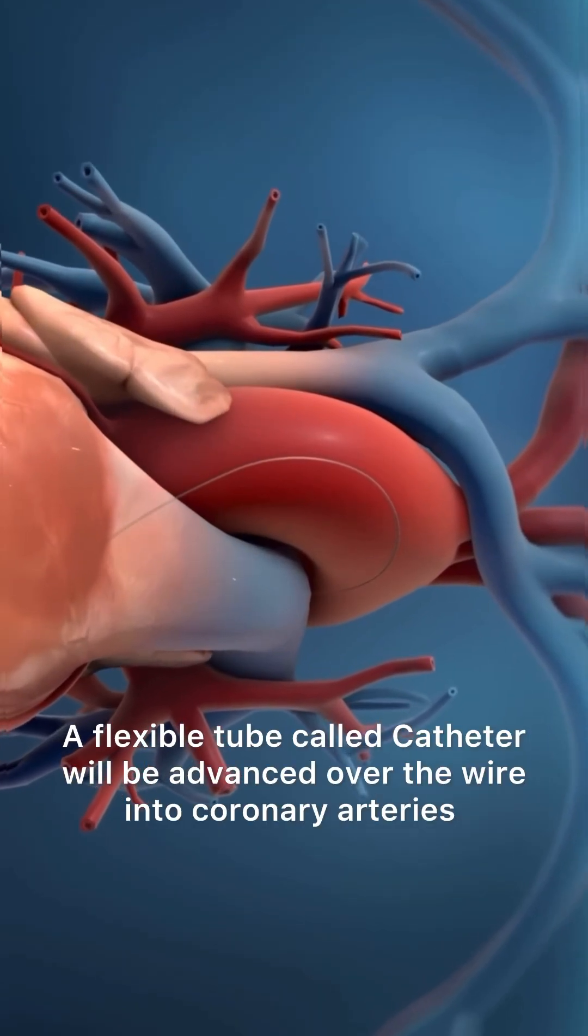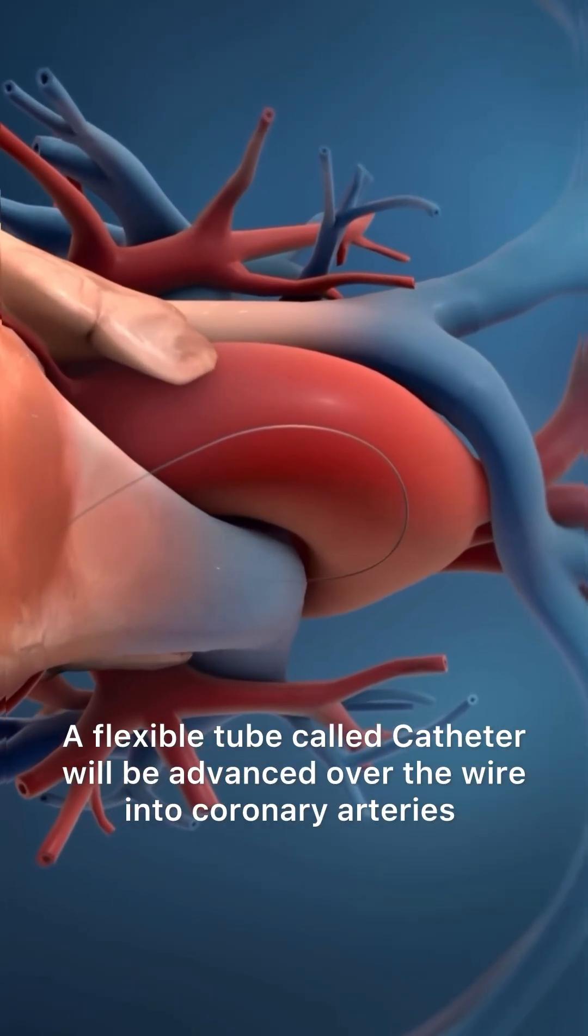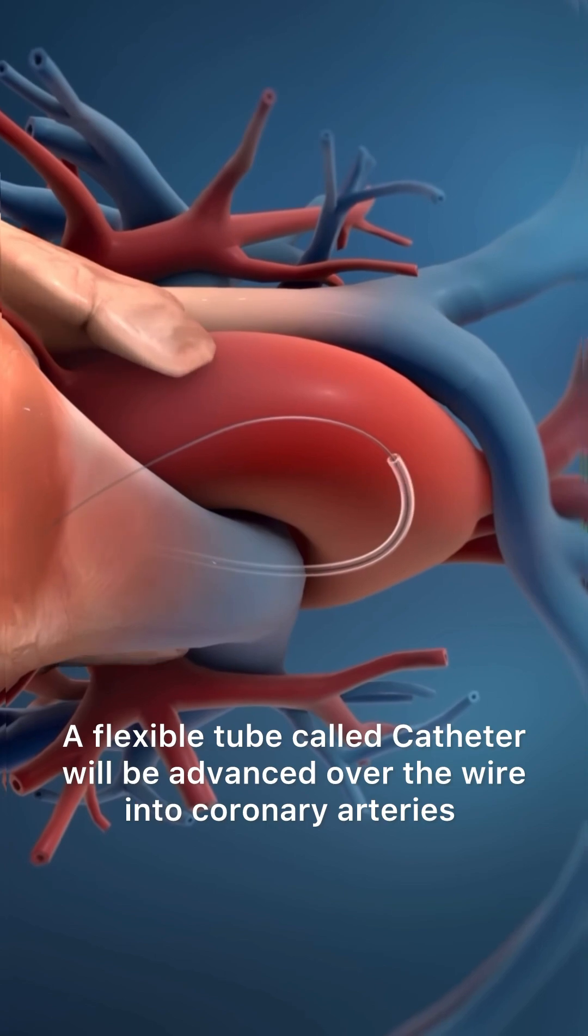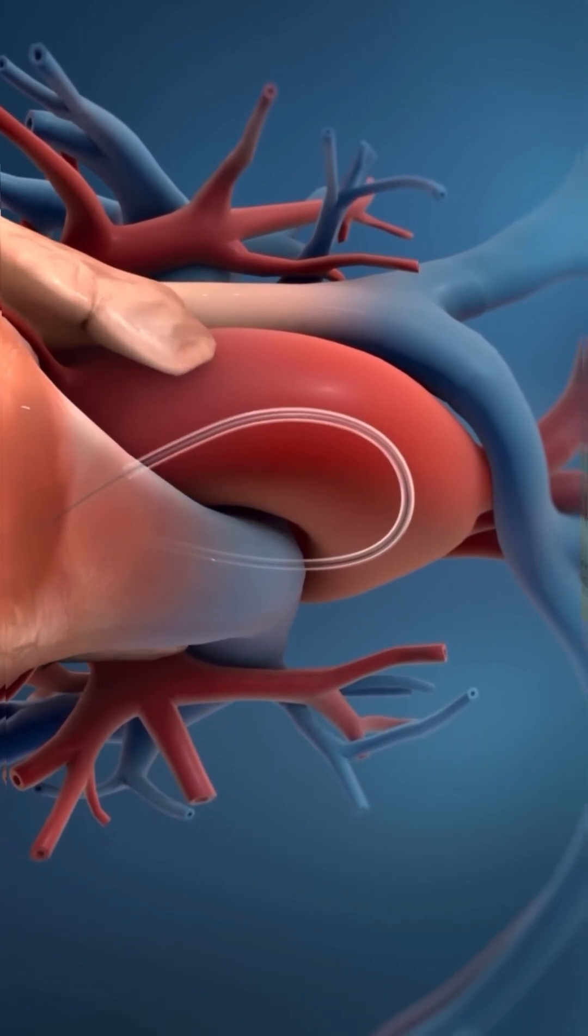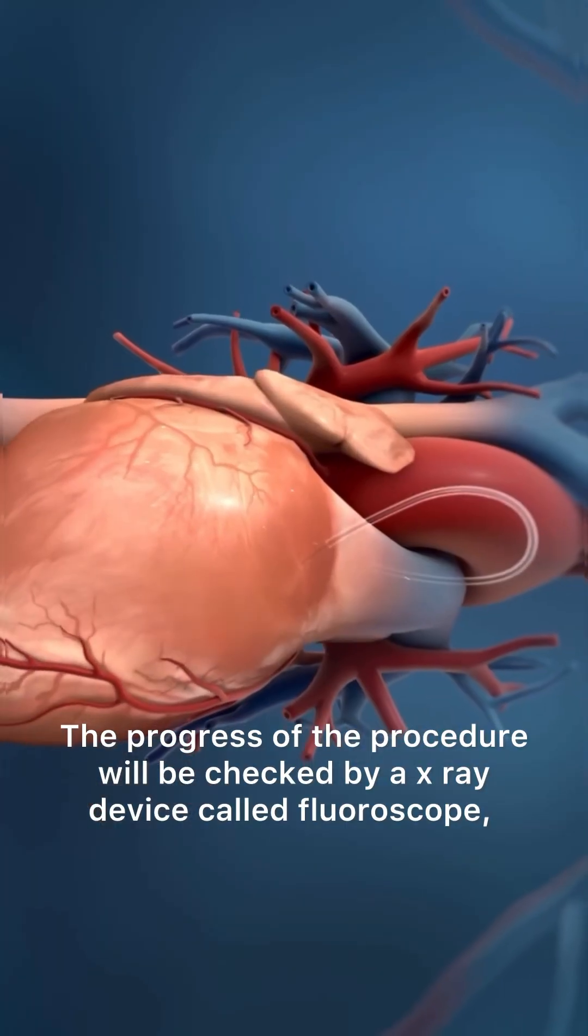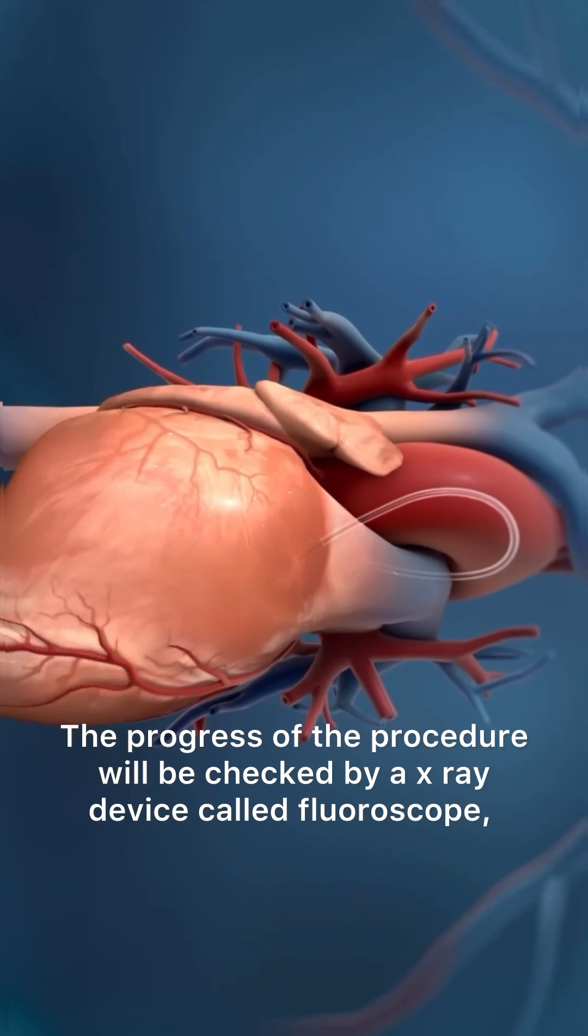A flexible tube called a catheter will be advanced over the wire into the coronary arteries. The progress of the procedure will be checked by an X-ray device called a fluoroscope.